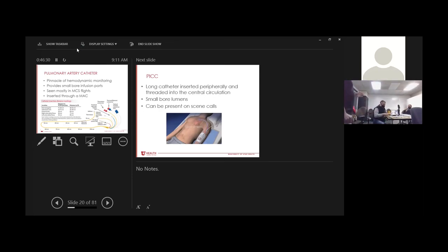And so like I said, next week you're all going to CVICU, SICU, and burn. When you're in CVICU, I really want you to ask them to see the swan patients. I want you to look at the swans and go over what ports are where, what transducer goes to what ports, what sticks to inject in, what's not. You can see this in real life as a tangled heap on the bed, and that's really good practice. Gail is going to be precepting, I believe, and she's amazing.